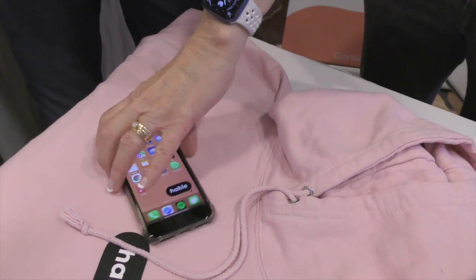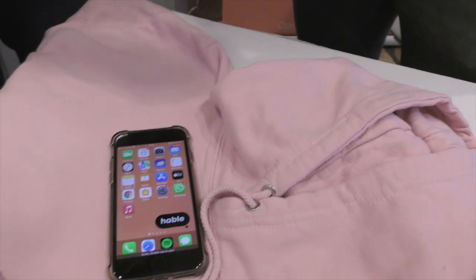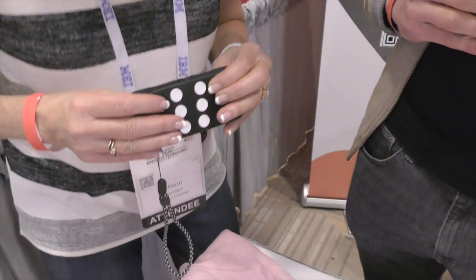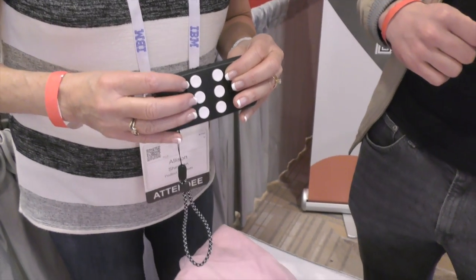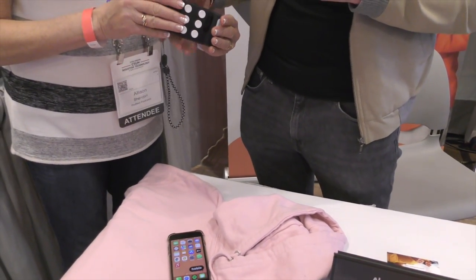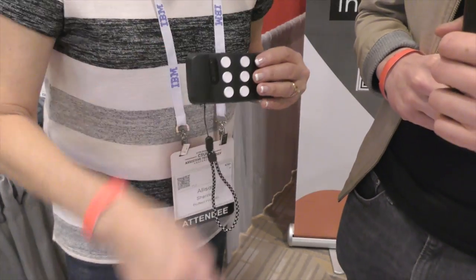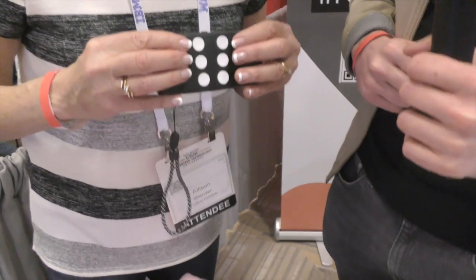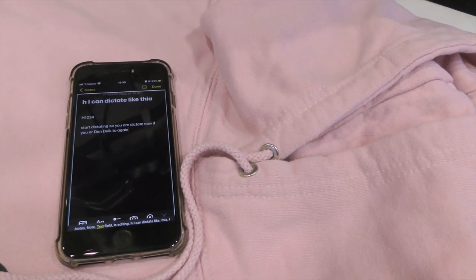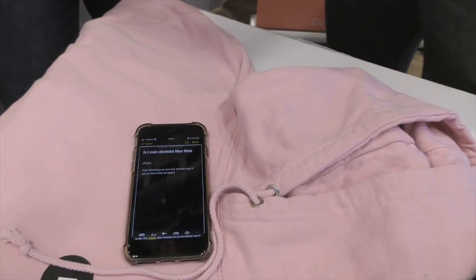So moving an item forward, you have the two big function keys. You hold down the left function key and keep holding it down, and press the other function key once. He's got to wake it up — so you should feel some vibrations. So I'm going to hold the left button and then the right button to move. We go back to the home screen by just holding down the H in Braille — dots 1, 2, and 5.